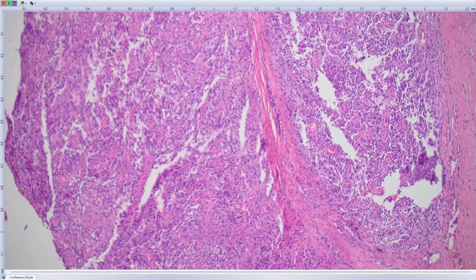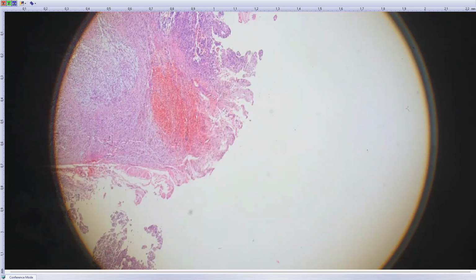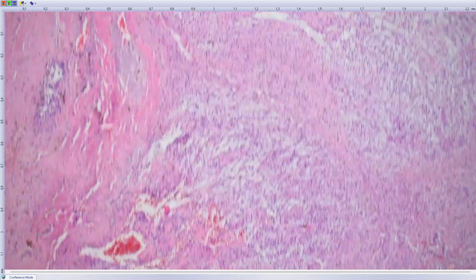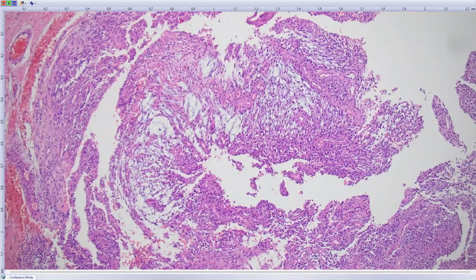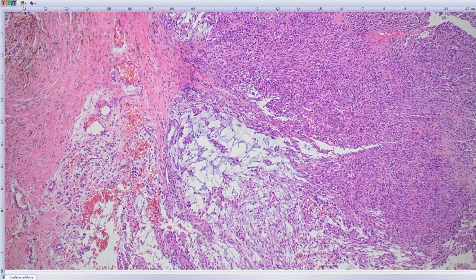And immunohistochemistry, again, not helpful. This is an older case, so I must say, I recall I had no idea what this is. I kind of dismissed these more myxoid zones, and actually the diagnosis is the same. It's the extraskeletal myxoid chondrosarcoma. It's a rare so-called solid variant, which is more and more described thanks to widespread availability of next generation sequencing. So we pick up these fusions which cause this tumor, and we retrospectively look at the morphology and then publish about it and pretend we are so smart. But it's very challenging diagnosis.